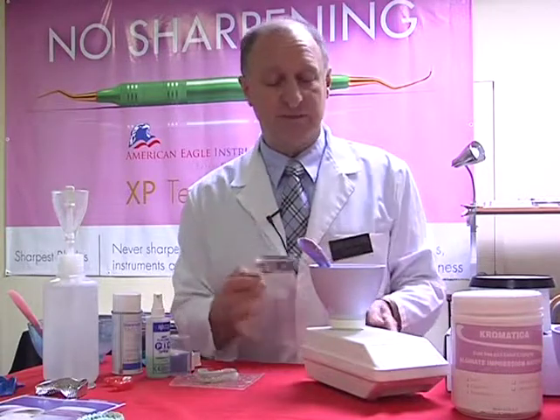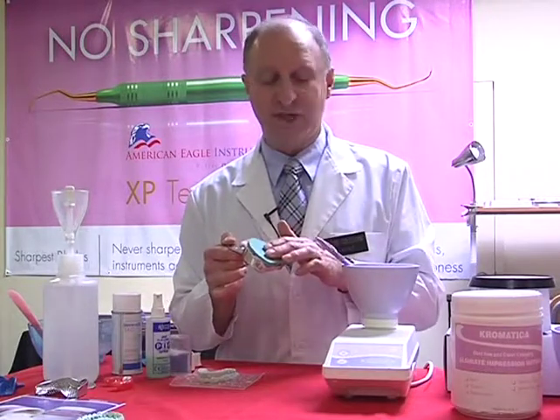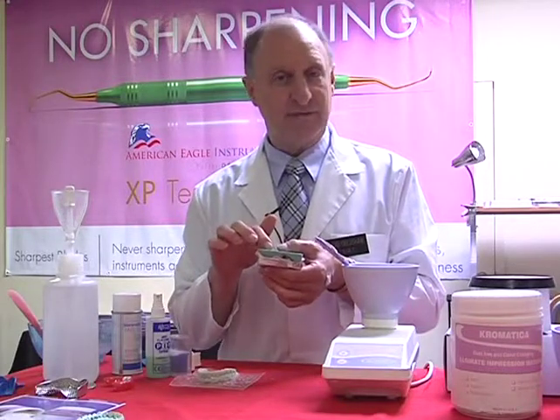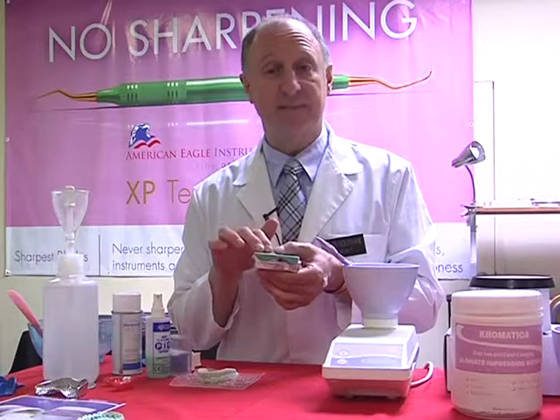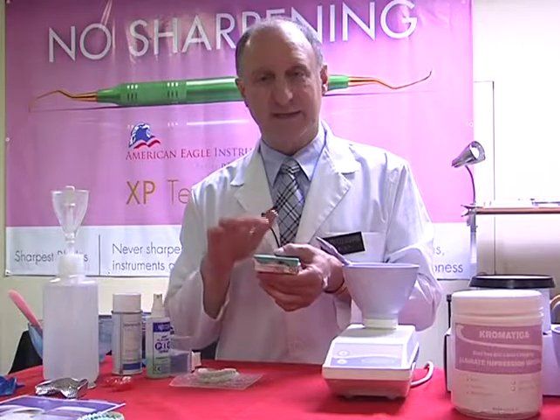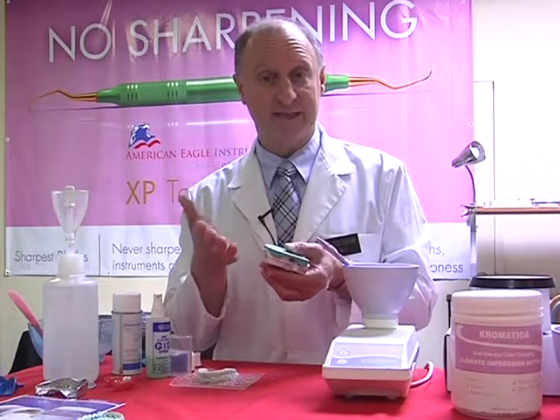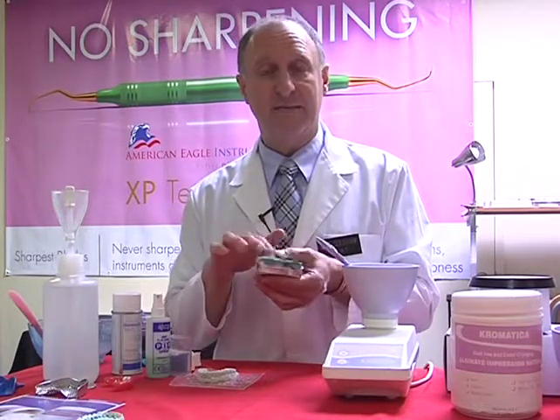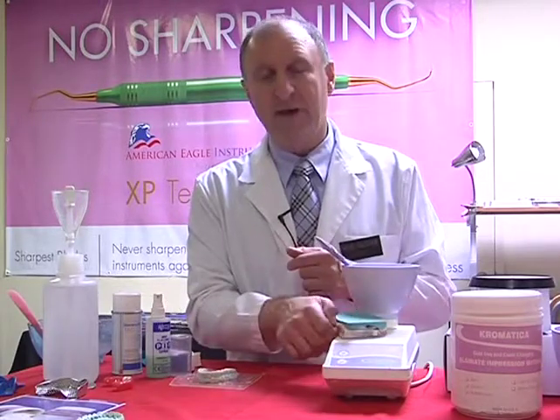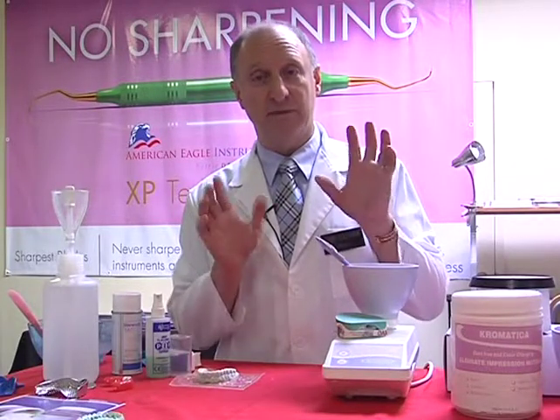Now, this does have a choice of mint, cherry, or bubblegum flavoring. We can choose. I prefer personally the cherry, but in the case of working with a material that has a flavoring, when this goes into the mouth, the flavor disappears and it's just leaving a scent. The idea with that is it actually makes the patient still think there's flavor, but it cuts down on the salivation so they don't produce saliva with a mouthful of impression tray and material and then saliva when they end up gagging. So this now becomes a little bit more gag resistant, which of course is much kinder to the patient. So after our 20 seconds, we're then going to obviously open up, and then we'll talk about how to pour the perfect model.